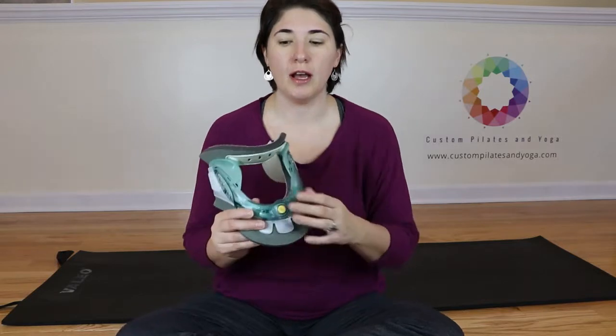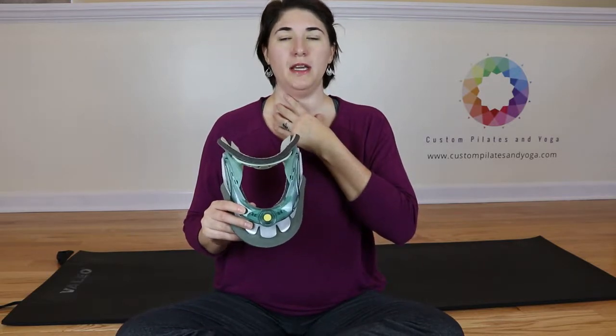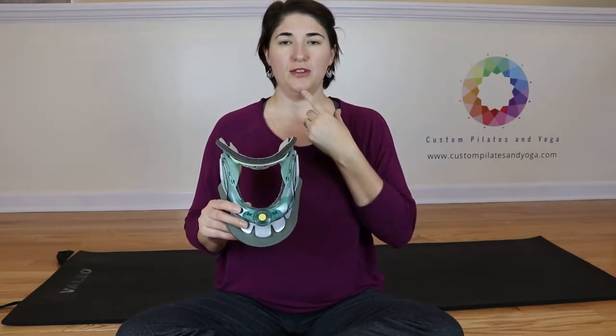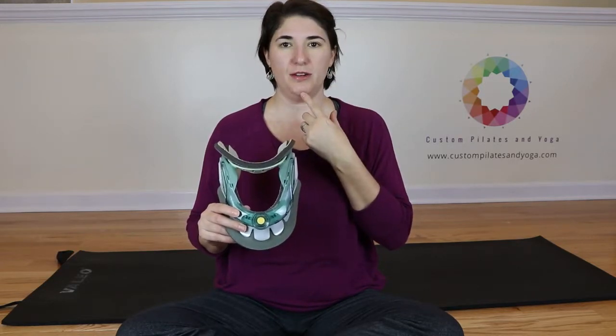So if something happens and you feel like you need to adjust your collar, you want to be in that position where you're nice and neutral and your chin should be down just a little bit, as opposed to up, like we tend to like to do.